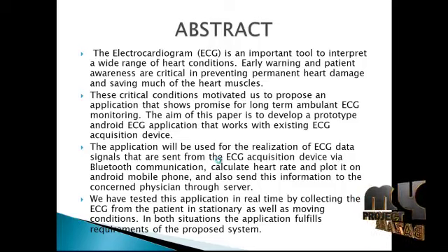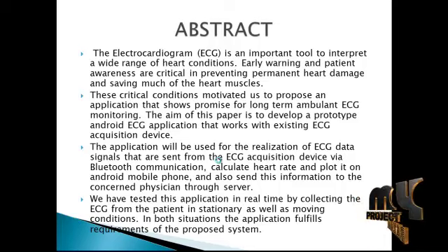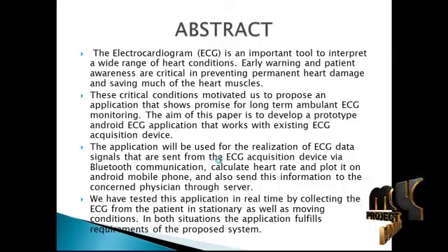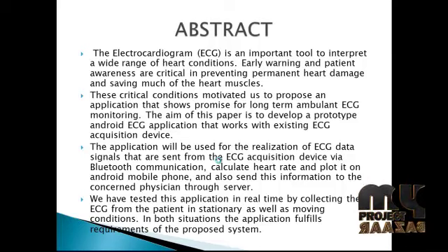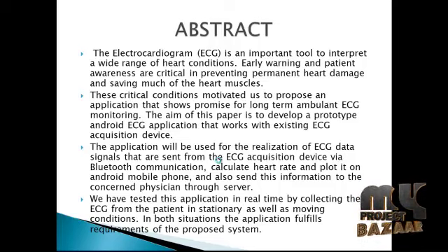First, the ECG signal grapher contains a way to measure and diagnose the abnormal rhythms of the heart. The output of the ECG record is a graph on paper or software with the voltage representation on the y-axis and the time representation on the x-axis. A dedicated ECG machine would usually print out the graph paper having a background pattern of 1 mm squares, usually in green or red, with a bold deviation every 5 mm in both horizontal and vertical.